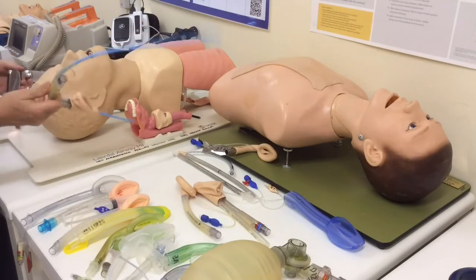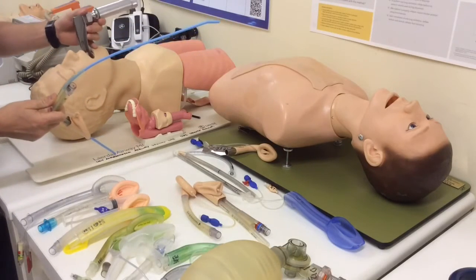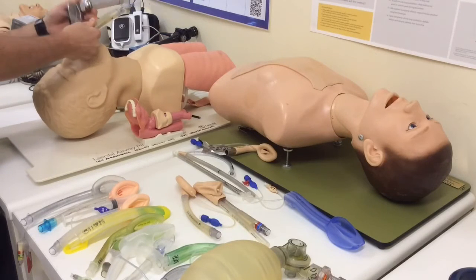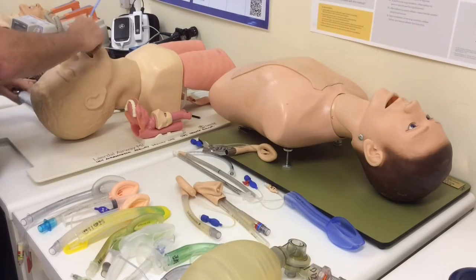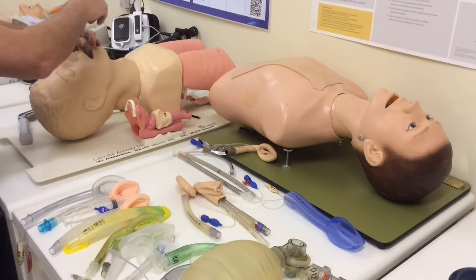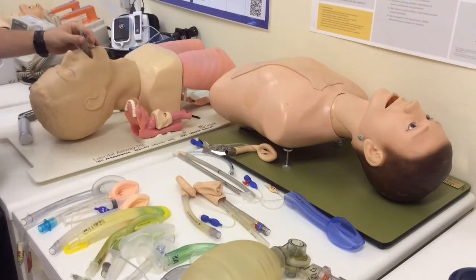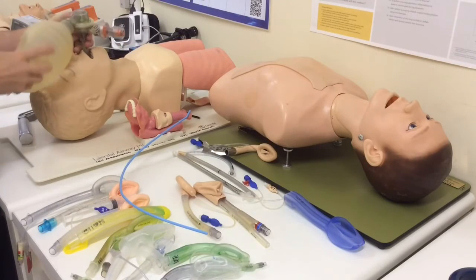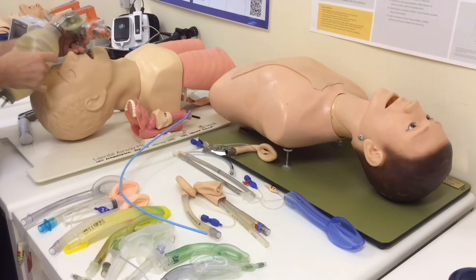Often if you're struggling with placement of your supraglottic airway, this is where you can actually use your laryngoscope to open the mouth, deliberately place the bougie down the esophagus, use it to feed the supraglottic into place, and then withdraw on your bougie, inflate your cuff, and that should have placed the tip in the perfect spot and allow you to ventilate the patient.